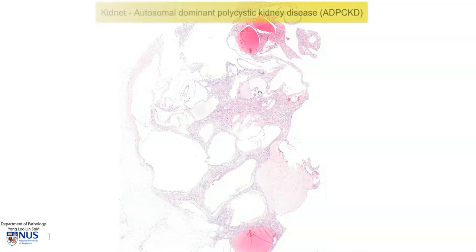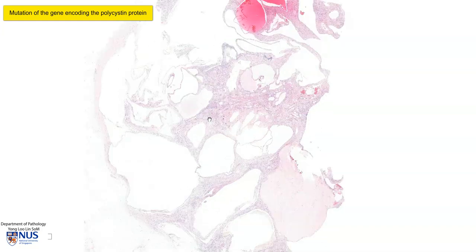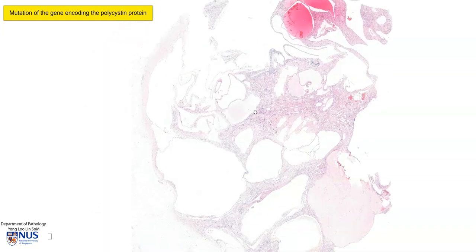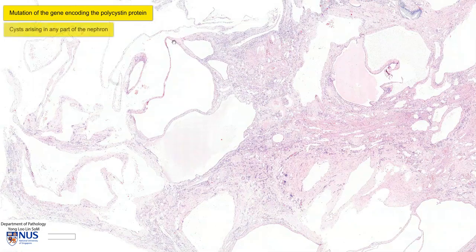Hello, this is a virtual microscopy slide of a case of autosomal dominant polycystic kidney disease. This is a genetic condition that occurs when there is mutation of the gene that encodes the polycystin protein. The exact mechanism of cyst formation is still unknown, but what we have is multiple cysts that occur in any part of the nephron.